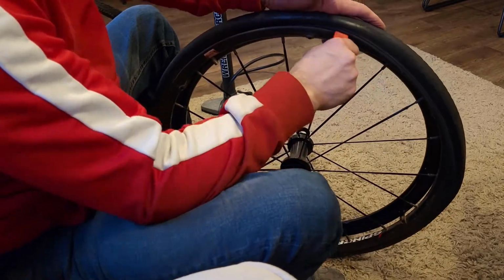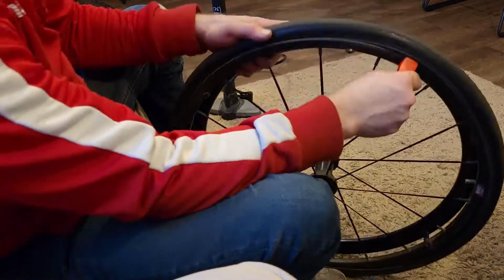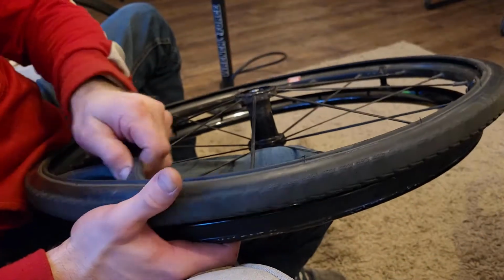And you saw that other tyre lever ping off, so do watch your eyes if it's going to come back at you. Once you've got the bead off the edge, you can just run the tyre lever around the inside and it'll slip the bead over the rim, and you'll be able to access the tyre and slip it straight off. Now what I'm going to do is look at where the valve is. I'm going to go to the opposite side of the wheel and pull the inner tube out.